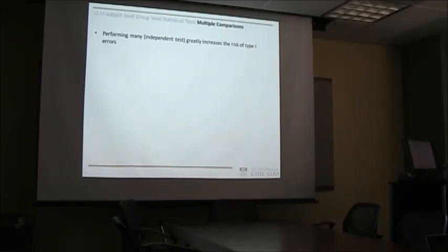As everyone probably knows, usually you would use an alpha level, an acceptable type 1 error risk, of say 0.05, which means that if you ran some experiment a ton of times, then in 5% of the cases you would declare something as being a significant effect, when actually it might have just been due to noise, right?